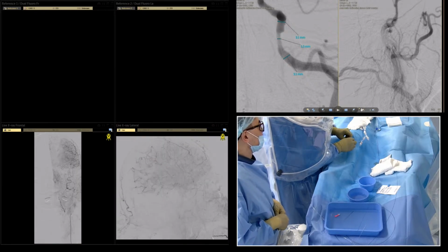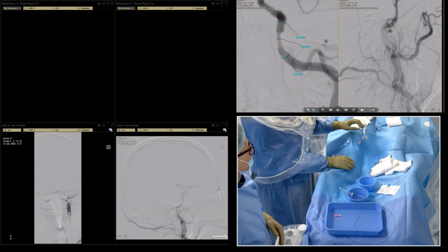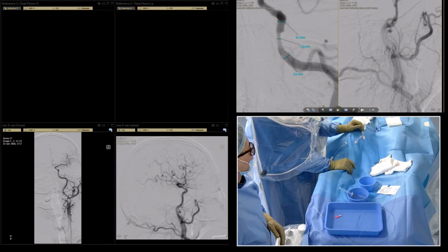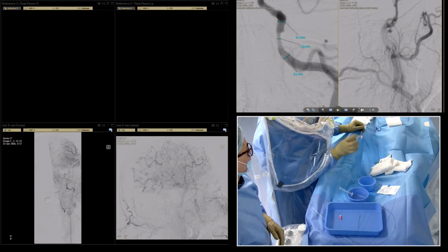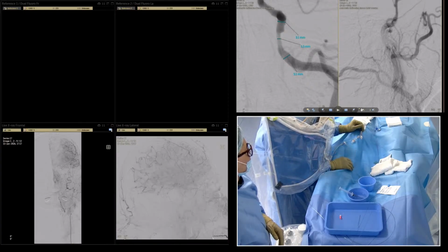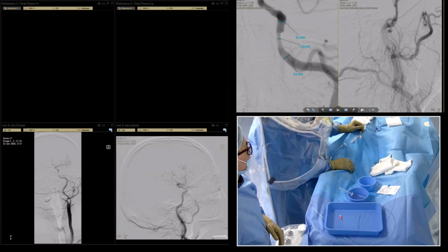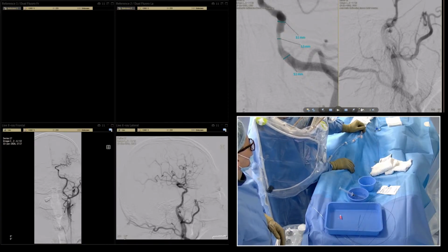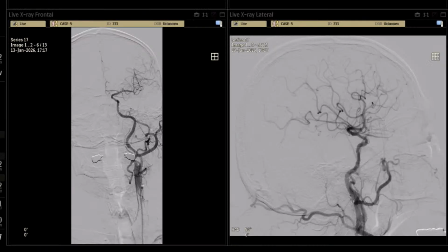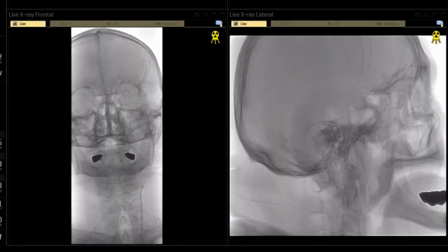Yes, that's okay. Yes, it's a double mesh protection device inside the stent. That's why we can finish with this side, and the pulse is 70, which means we can do this second side. Okay, just a second. Let's check the full stent.